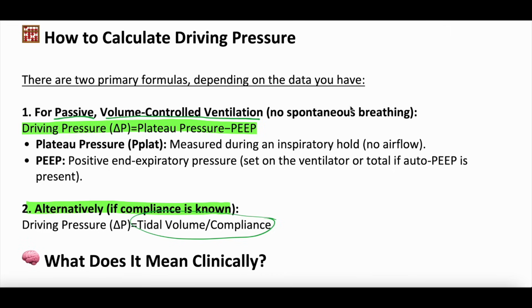And what you have to do is get a plateau pressure. If you do not know what a plateau pressure is, this video is probably a little beyond where you're at. We have a whole playlist on all things mechanical ventilation where we dive into plateau pressure. It's linked in this episode's description, so definitely check that out and then return to this.